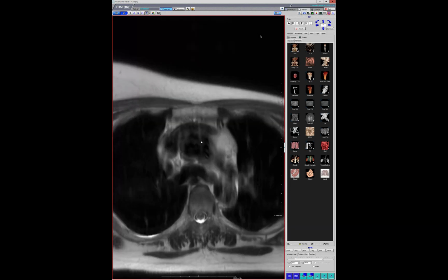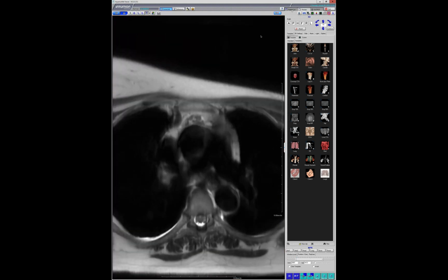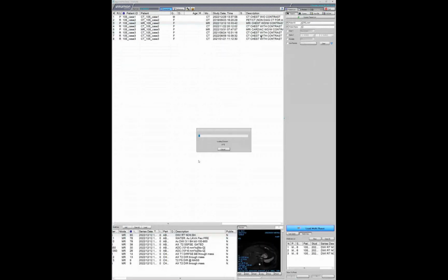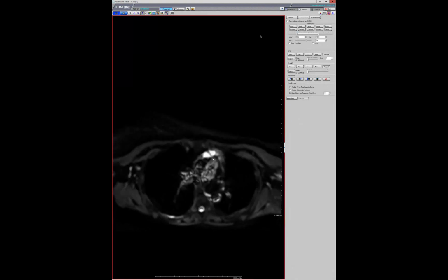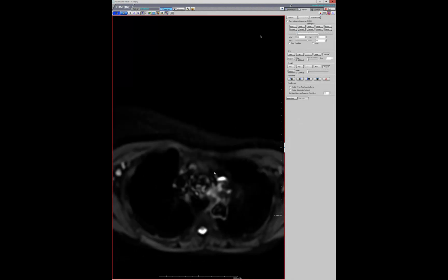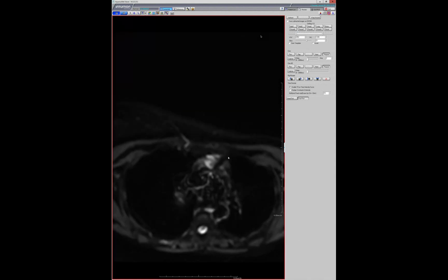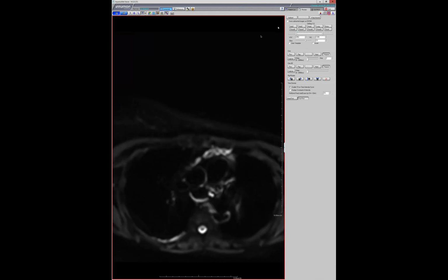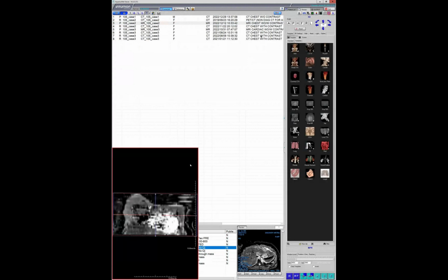I'll show you the diffusion weighted imaging, because most of the images are not very good. You would think they would cardiac gate some of these, but they don't. But anyway, all these areas that were low attenuation on the CT, if you put them side by side, directly correspond to these areas of high signal on the DWI that do show T2 shine through on the ADC map. I'd be almost embarrassed to show you our ADC map, but here we go.